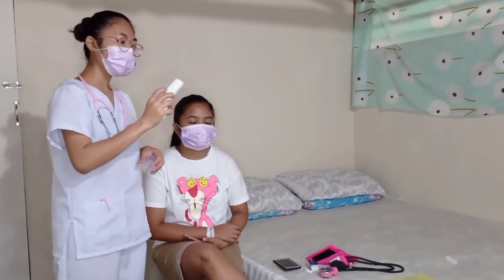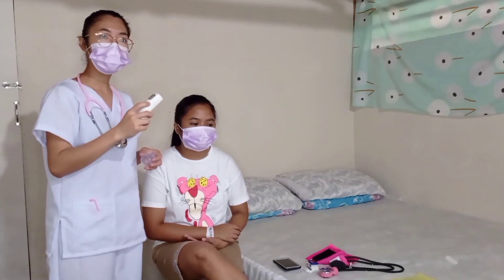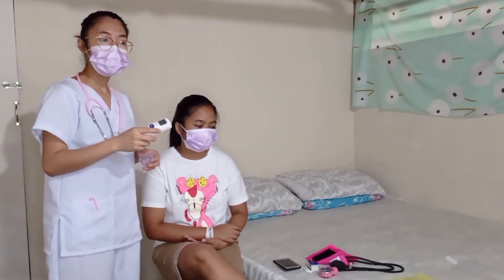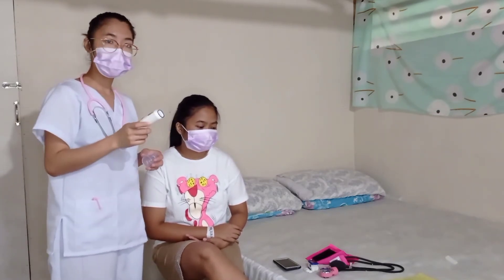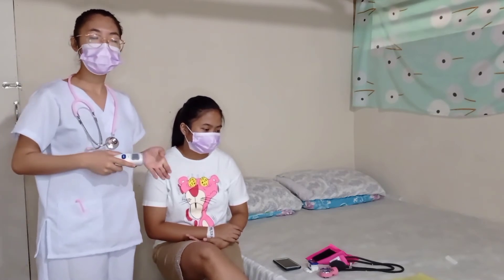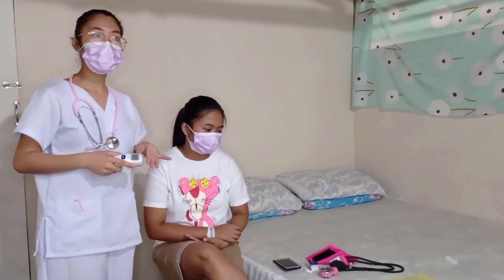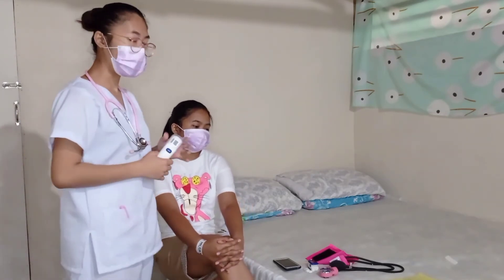The normal body temperature is 97 to 99 degrees Fahrenheit. My client's body temperature is 97 degrees Fahrenheit, which is normal. An adult fever is defined as 100.4 degrees Fahrenheit, so her temperature is normal.